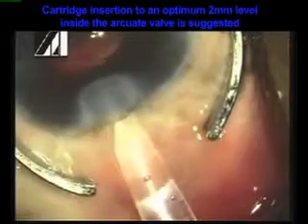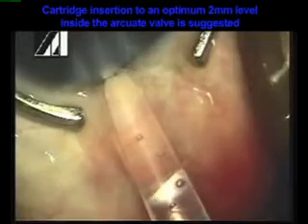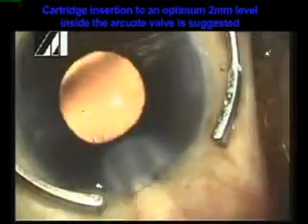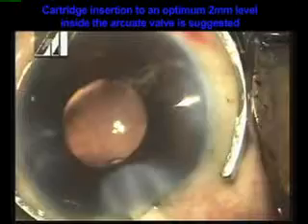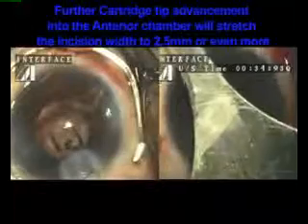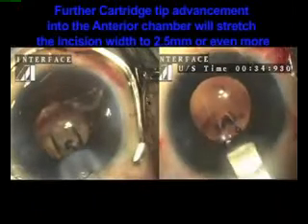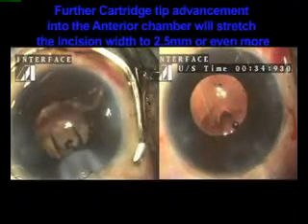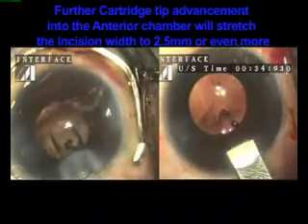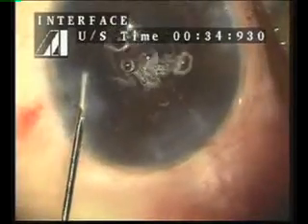While adopting this procedure, the tapered cartridge tip should not be advanced too much into the incision. This might stretch the incision and increase the passive incision size, exceeding the required limitation of 2.5 mm and inducing surgical astigmatism. As the arcuate chord length created is 2 mm or even more, stromal hydration is not performed in all the patients.